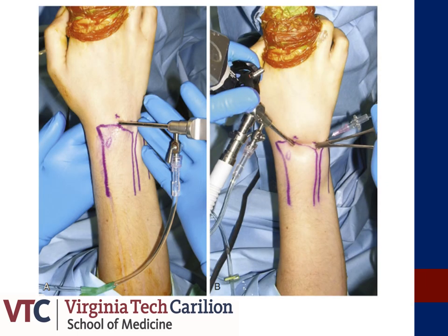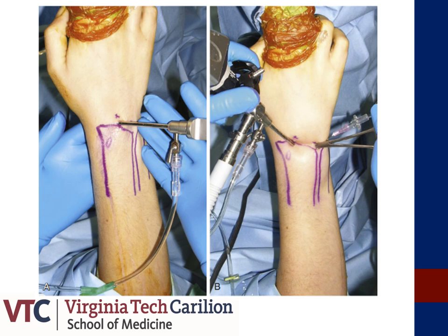Here is a depiction of the 3-4 and 4-5 portals. The 3-4 portal lies just distal to Lister's tubercle between the EPL and the EDC tendons, while the 4-5 portal is located in line with the ring finger metacarpal between the EDC and EDM tendons.